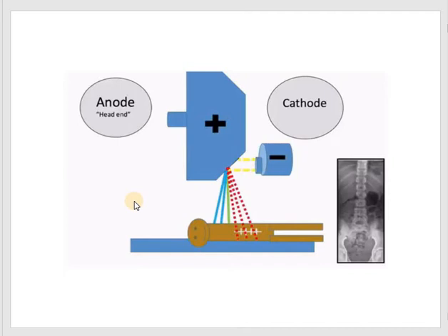Let's have a look at this diagram. The angle at which X-rays emerge from the target surface toward the patient varies. The intensity varies and causes some X-rays to be absorbed in the heel of the anode. The heel attenuates a portion of the X-ray beam, which leaves X-ray photons with less intensity on the anode side of the patient.